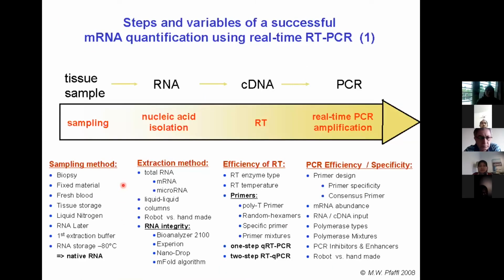So this is the detail of the steps. Sampling requires expert people to take the swab, the throat swab, as well as the nasopharyngeal sample, and then the extraction as well as the purification. You can see this is the extraction method. This is the sampling method, and then converting the RNA to cDNA, followed by amplification and fluorescence. There are many other techniques, but here I'm talking about fluorescence, the TaqMan probe.